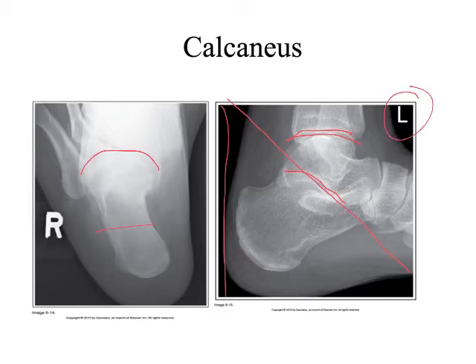We kind of want to see a nice little 95-degree angle right here, if possible, just because that's going to allow us to evaluate these joints as clearly as possible, right? And then we more or less have the mid-calcaneus at the center of the exposure field, and we can establish that by doing a crosshair method, right? And I think that's it. At minimum, a calcaneus needs to include this image. In all honesty, the other image is very, very difficult to get, I think, especially if you suspect fracture. But I have done them in the past. Occasionally they're helpful in the OR as well.